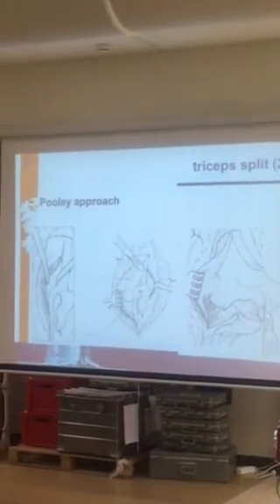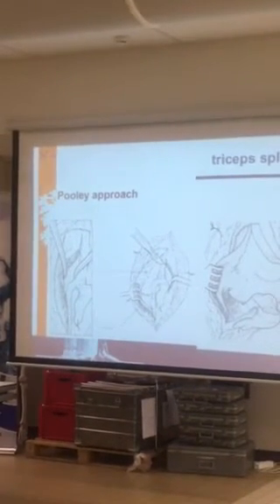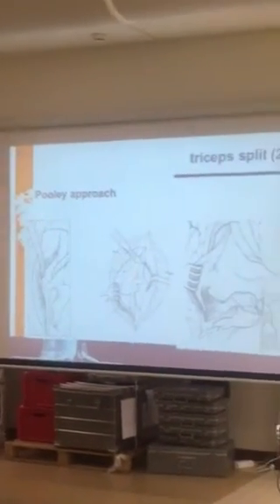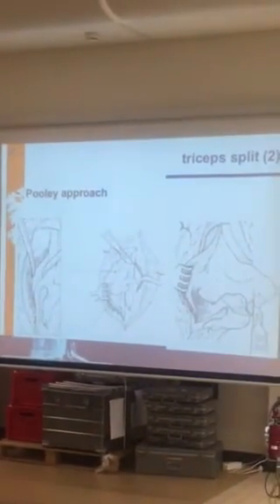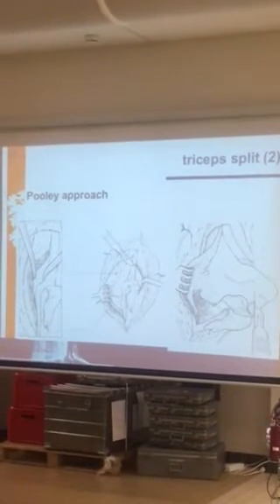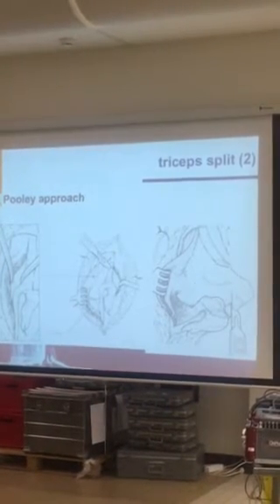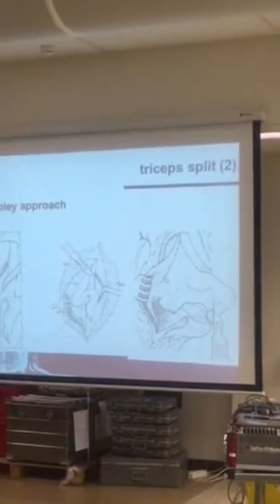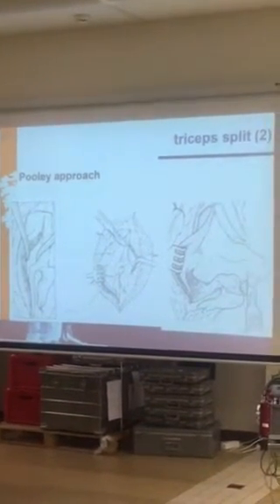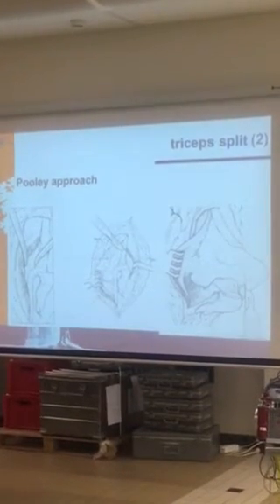So you keep as much muscle as possible in this way of preparing the triceps. Then you dissect the intermuscular septum, about 2 centimeters proximal from the olecranon, and create a medial window. In this case, you dislocate the elbow and you get a really large view on the ulna. It gives you a lot of overview. It's a nice way of doing it, but you have to repair the triceps afterwards.